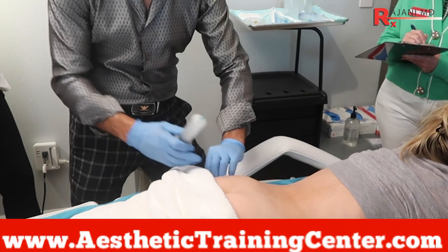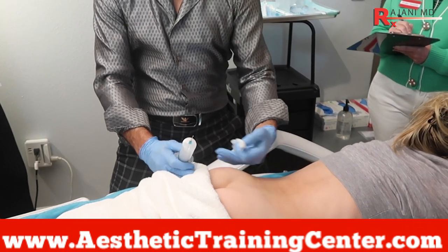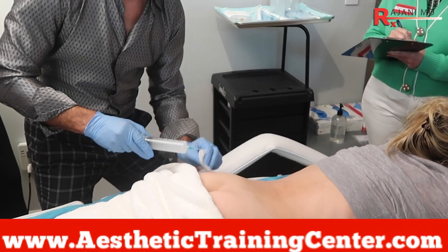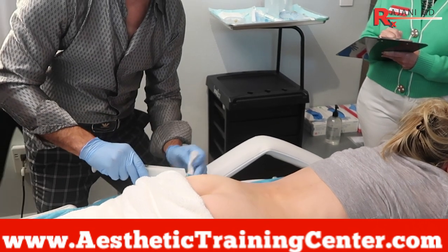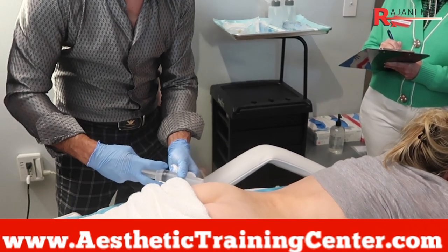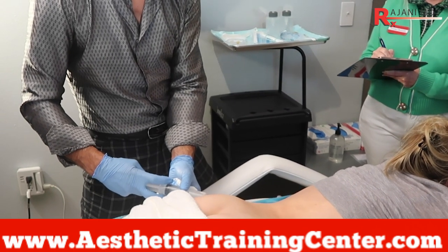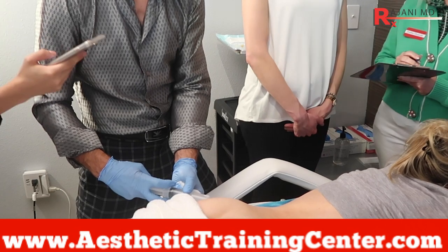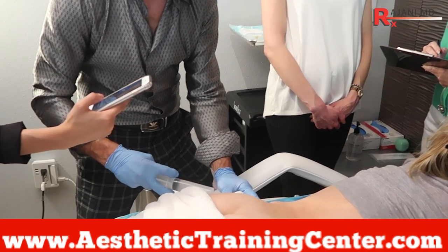I use a larger 60 ml syringe, though a 25 ml might be easier for many people. We use a 22 gauge cannula, 23, or even a 21 gauge needle depending on what we're doing. You want a longer needle to reach the areas we're targeting. Here, injecting in someone who's thin, we're in the upper pole — in the fat layer above the gluteus maximus.